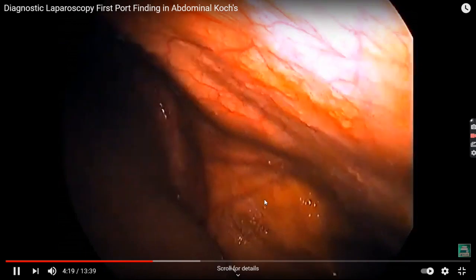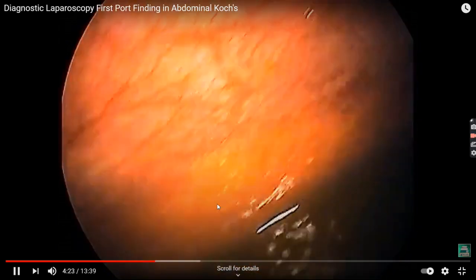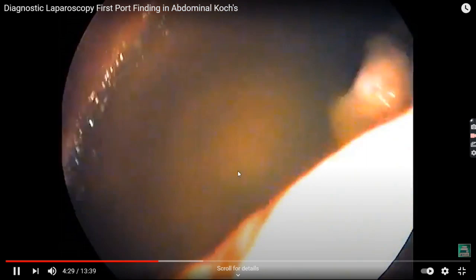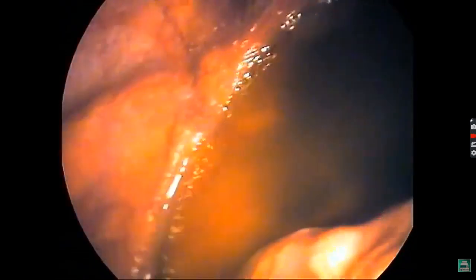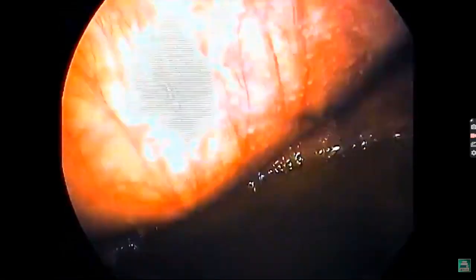Here again, and what is required after this diagnostic is to put another port, and through that port a suction should be introduced, and this is what is exactly required in this patient at this time.